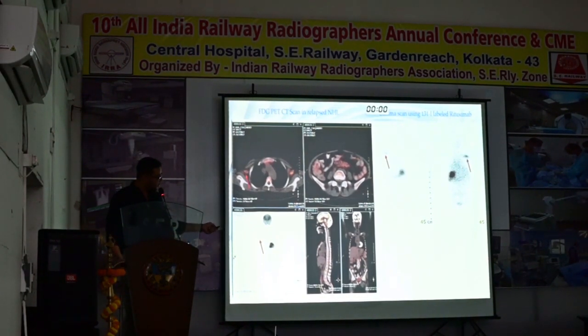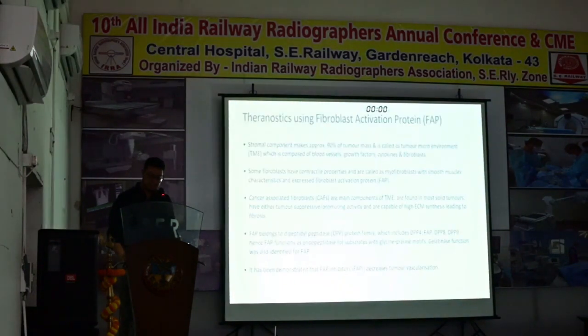So we have mapped the CD20 positive cells here with the help of this rituximab, and the patient will then get radioiodine labeled rituximab therapy.